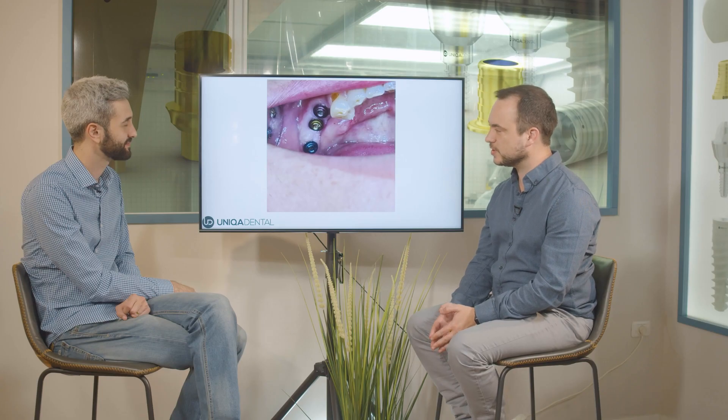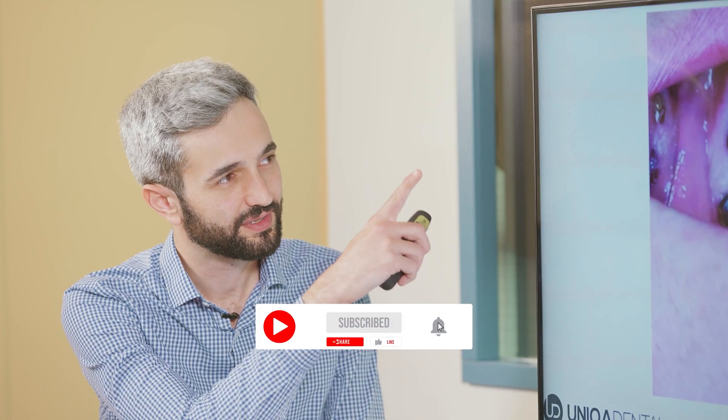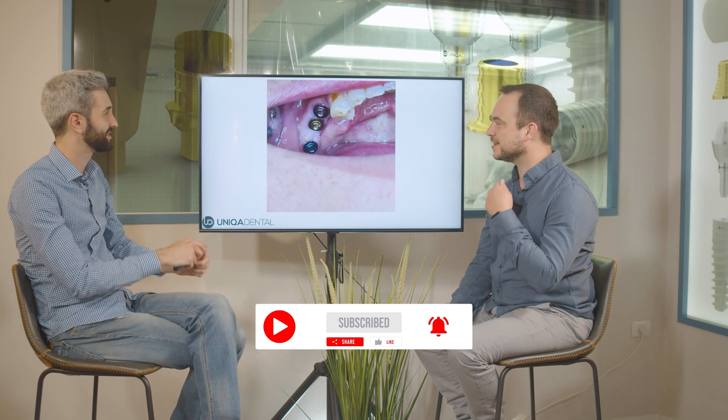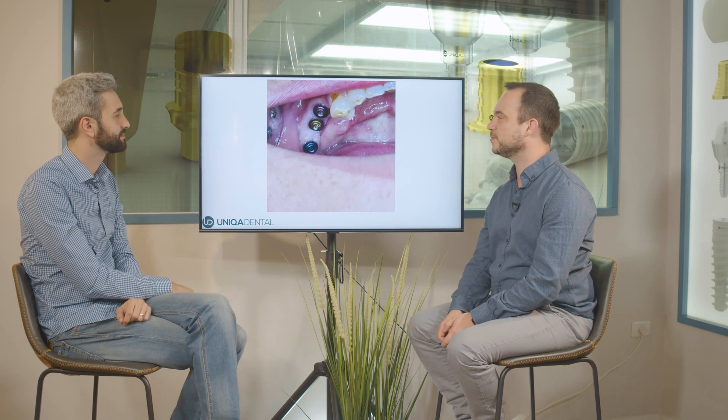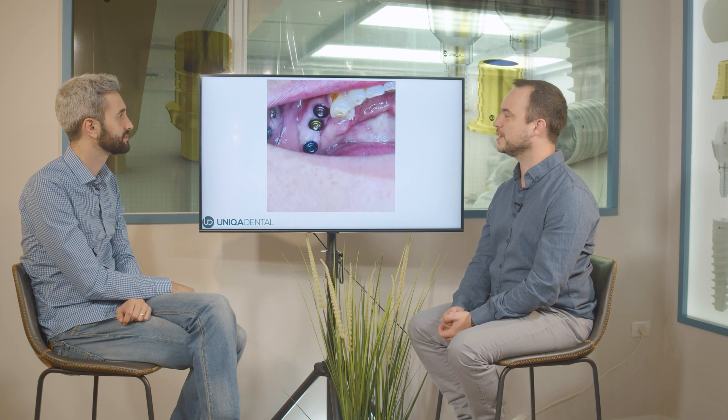Today we have a case of restoration on three implants and three multi-units. What is this? This is an abrasion, probably from tooth brushing — he's a very aggressive tooth brusher.